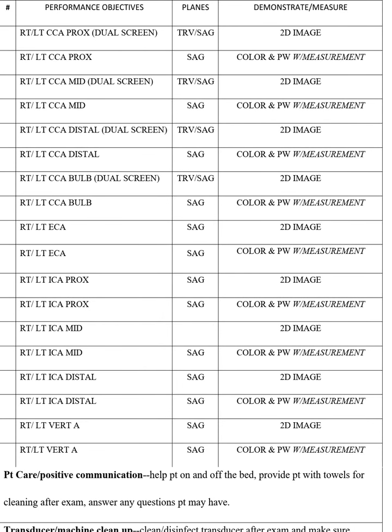We are both students in the DMS program here at Southwest University, and we created a short video on how to scan and go through the carotid artery protocol that's on the screen. As you can see, it consists of a right and left side of the CCA, which is your common carotid artery. We included the subclavian and innominate artery as well. You'll be seeing Myra's scan, and throughout I'll give a quick explanation on the images she's obtaining and how to obtain and evaluate these vessels.